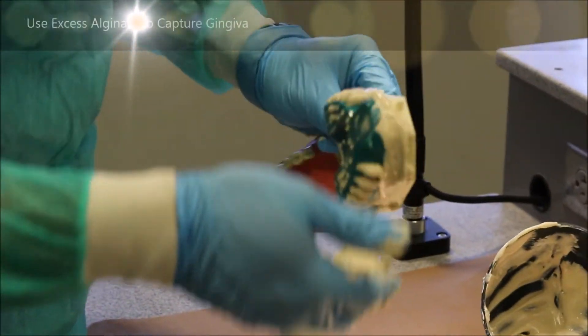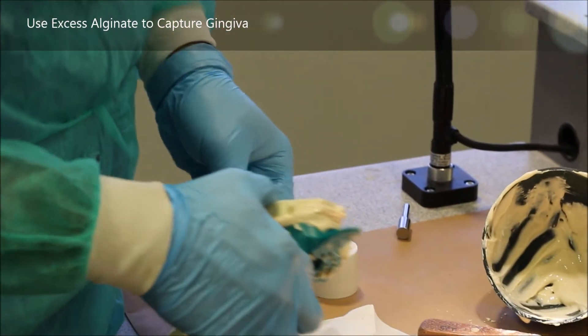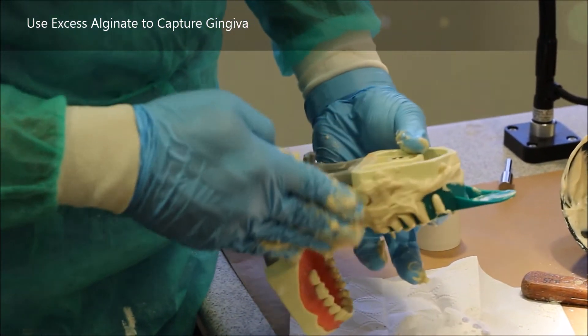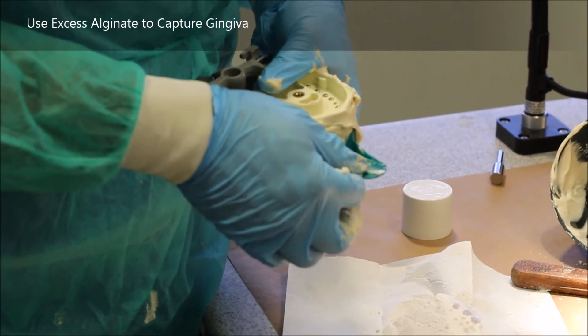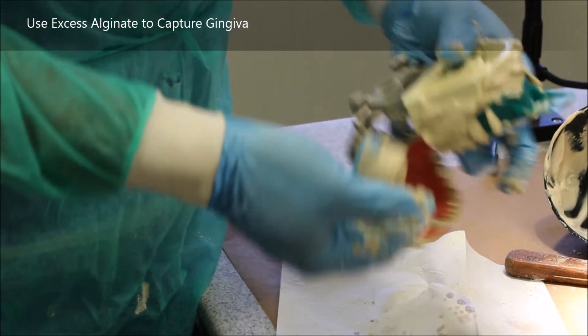Since this is a typodont that I'm trying to take the impression of and I don't have a lip that I could press down to roll, I'm simply going to take the excess alginate that I mixed and use it to ensure that I coat all the pink gingiva of the typodont.